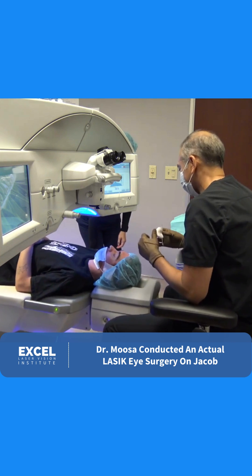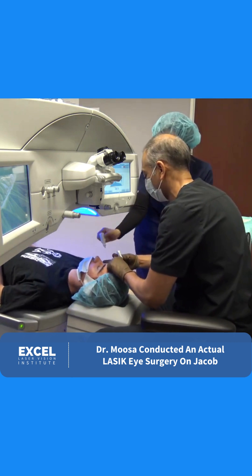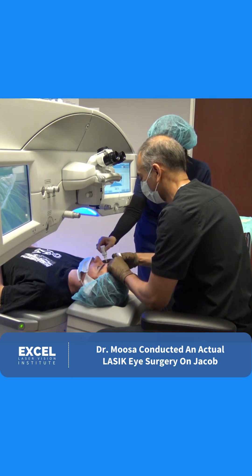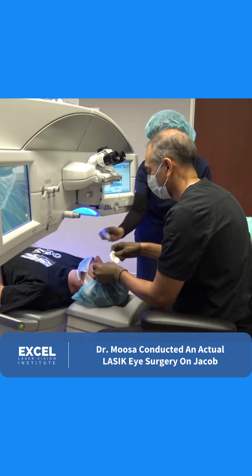Hey, you ready? So let's get you comfortable. The first thing I'm going to do is we're going to put some additional numbing drops in for you, Jacob. Go ahead and open your eyes for me. Beautiful. And now to your left eye. Excellent, Jacob. Close your eyes.